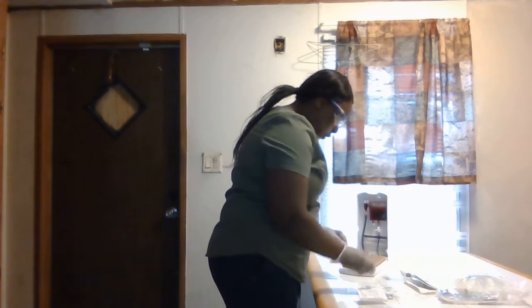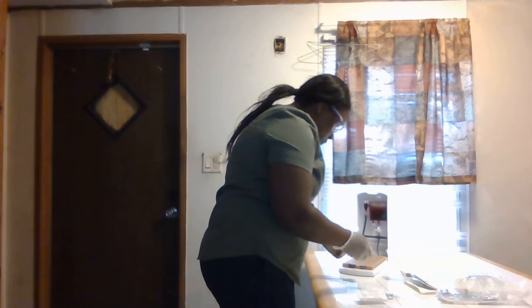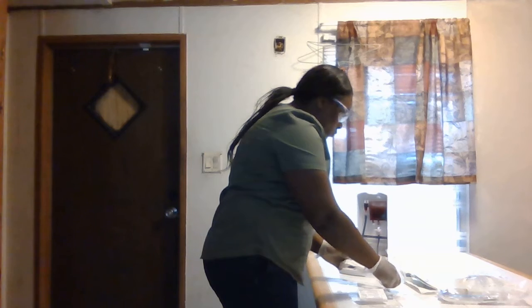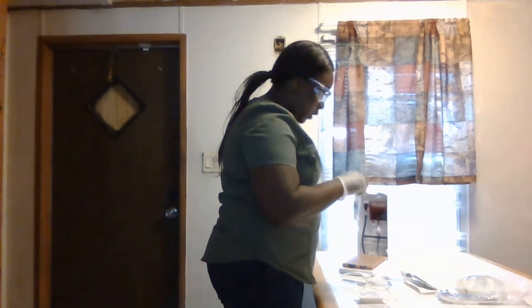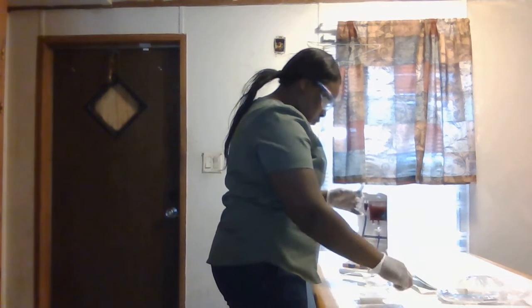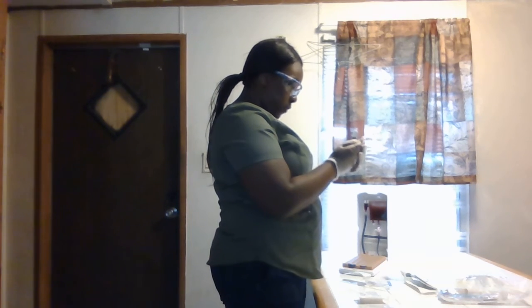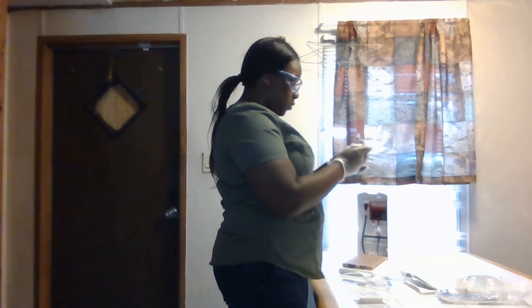Now I can go ahead and set up my extension. Always maintain the sterility. Alright, and I have my saline flush. Put that in my trash. I don't want anything on my clean surface. Always go ahead and remove the air that's in the syringe by pushing up on the plunger, removing any air.